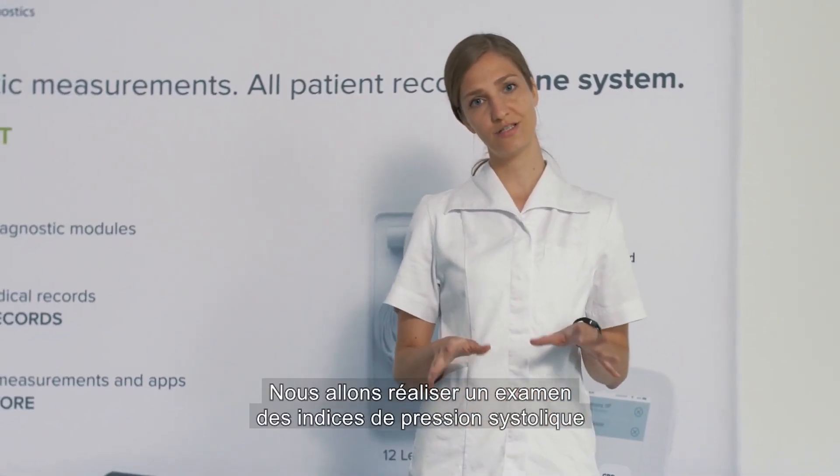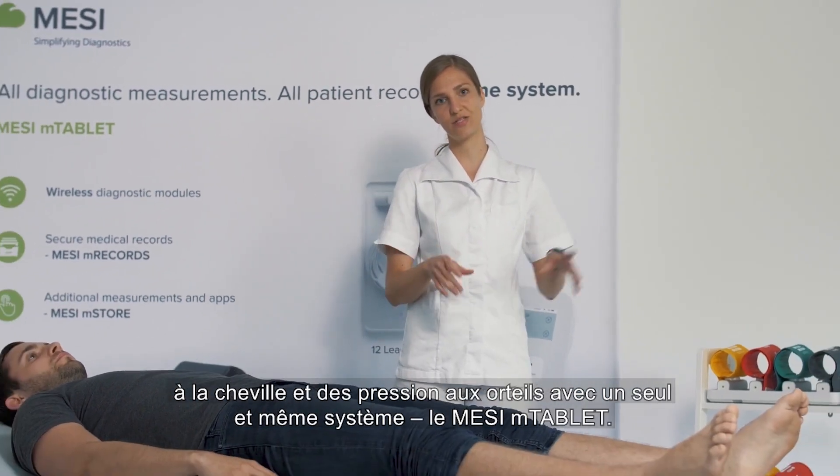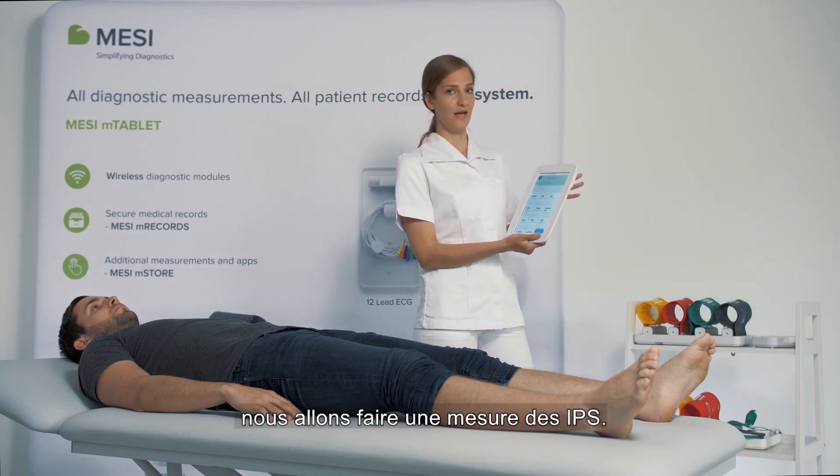We'll be performing a full arterial assessment — ankle brachial index and toe brachial index measurement — with one device, the MESI mTABLET. First, we will do the ABI measurement.